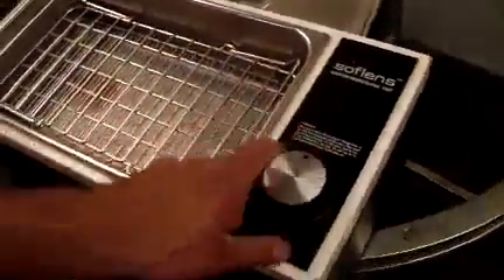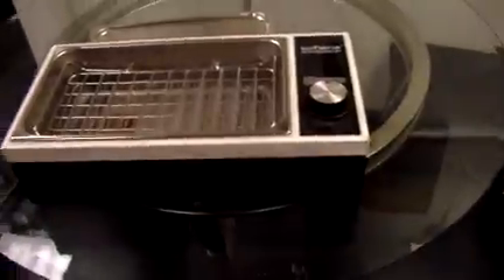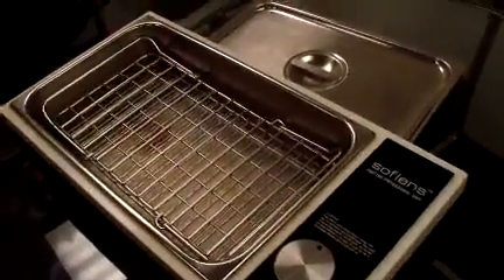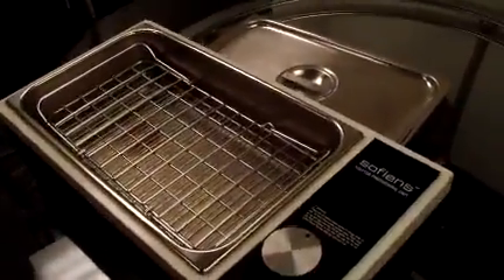I don't have the means to actually run all the tests on it, but upon request I could run water through it, heat it up, and take a temperature reading. I don't have any vials or anything like that to put into it.